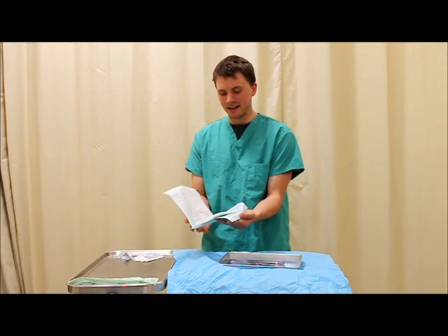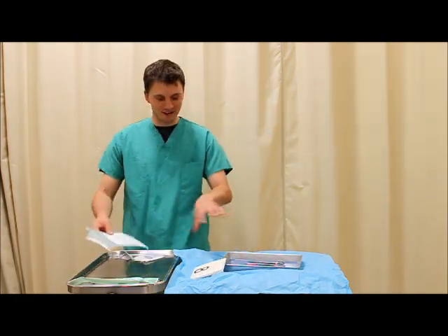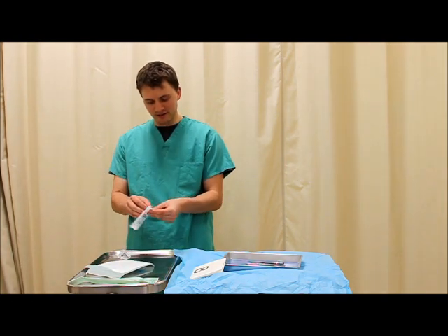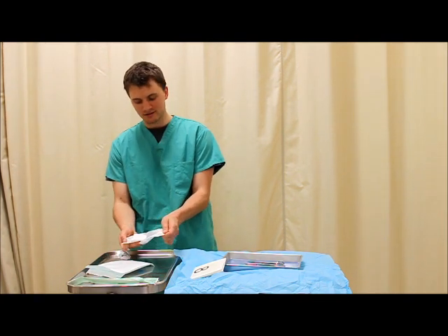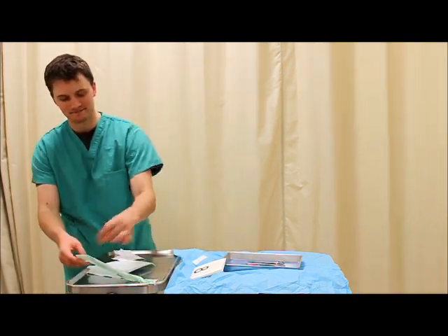And we're going to be opening up the pad, and then careful not to touch it, we're just laying the pad on top of the sterile area. And it's important to note not to work over the sterile area, to work to the side. Now we're going to move a 2x2 pad over using the same technique. We're opening it and putting it on the sterile portion of the sterile tray.